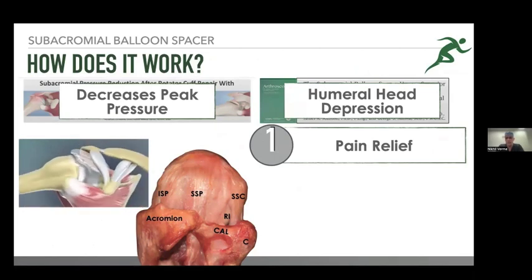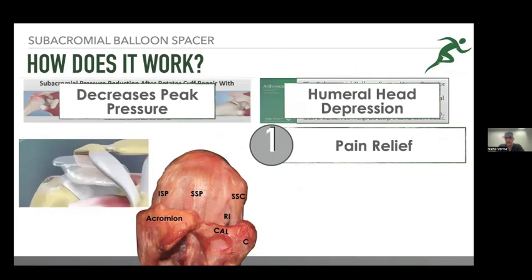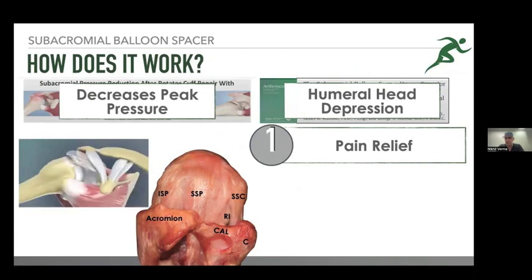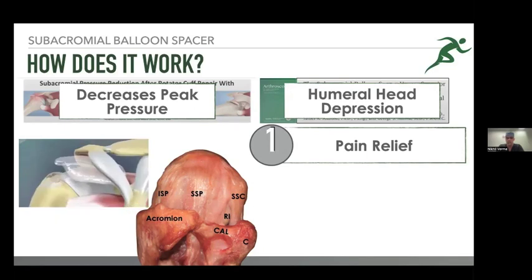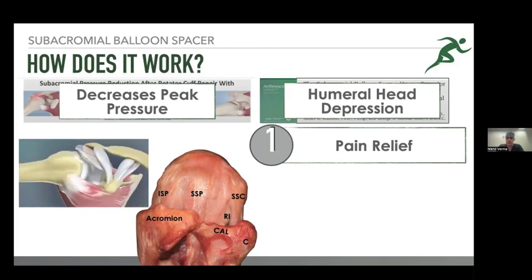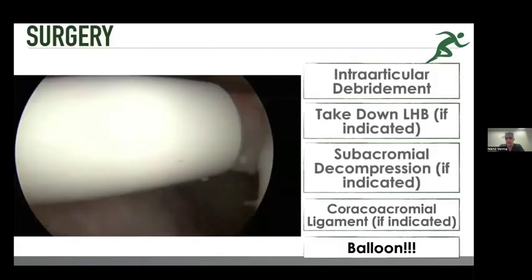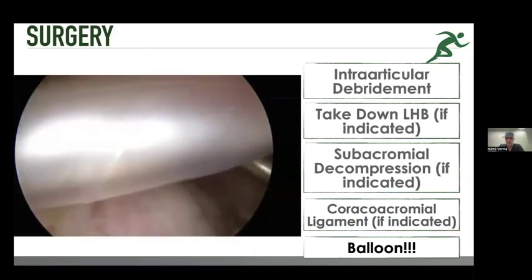And I think the best way that I think about this is, if you think about these patients, the vast majority of them have been asymptomatic but well-compensated patients for a long period of time. These rotator cuffs are not new, but something has happened that's tipped them over into a decompensated world. And so, like a cortisone injection, if we can render them asymptomatic and allow them a period of rehabilitation for deltoid reactivation, we can achieve pain relief, we can facilitate rehabilitation and achieve a good clinical outcome, even once the balloon is gone.